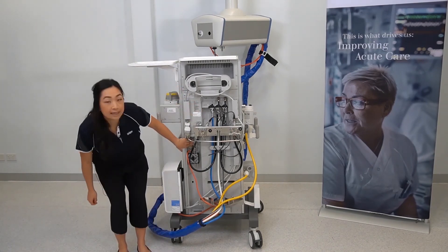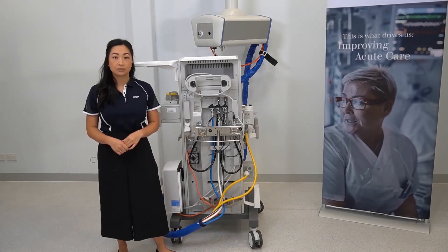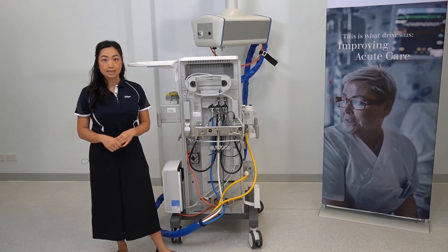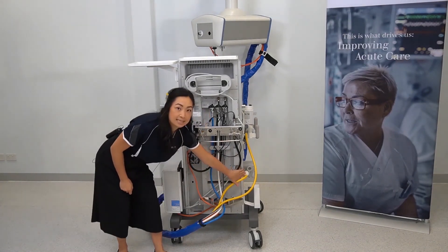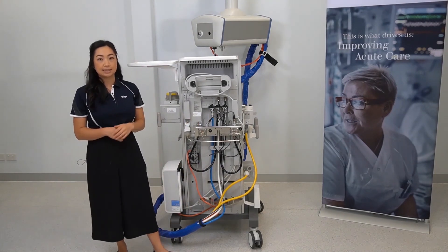Located down here is a power switch which may be switched off during the storage of the device. This will need to be switched on to operate the ATLAN A350. Located on the back of the anaesthetic gas scavenging system is a hose that connects up to your scavenging or suction system.